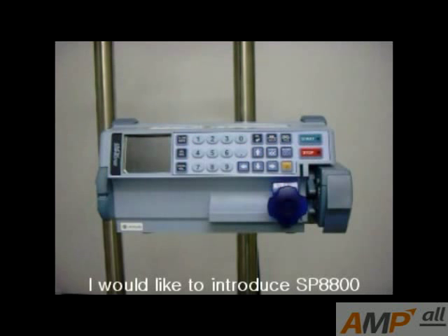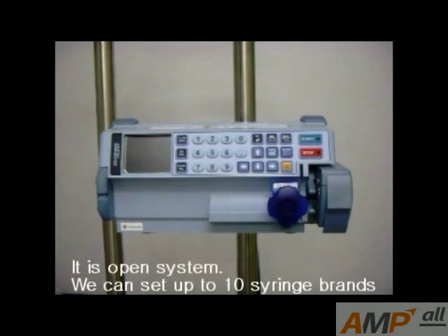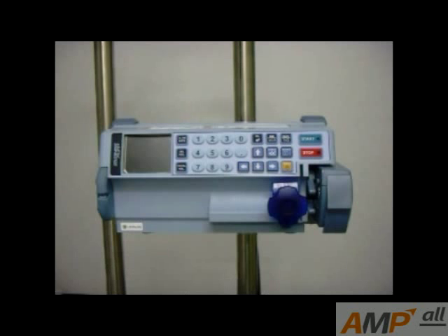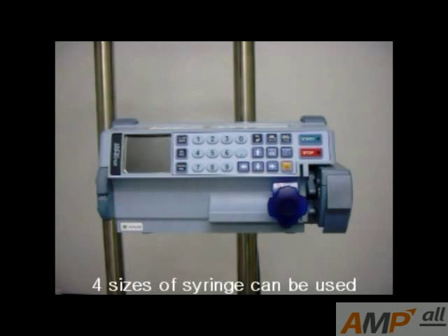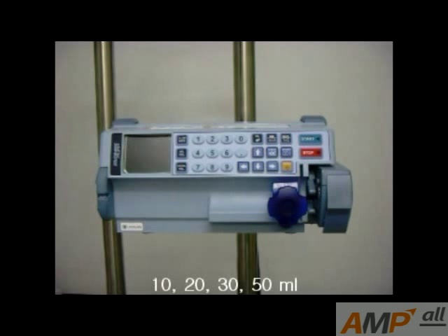I would like to introduce the SP8800. It is an open system. We can set up to 10 syringe brands, but only appointed syringes can be used in this product. Four sizes of syringes can be used: 10, 20, 30, and 50 ml.